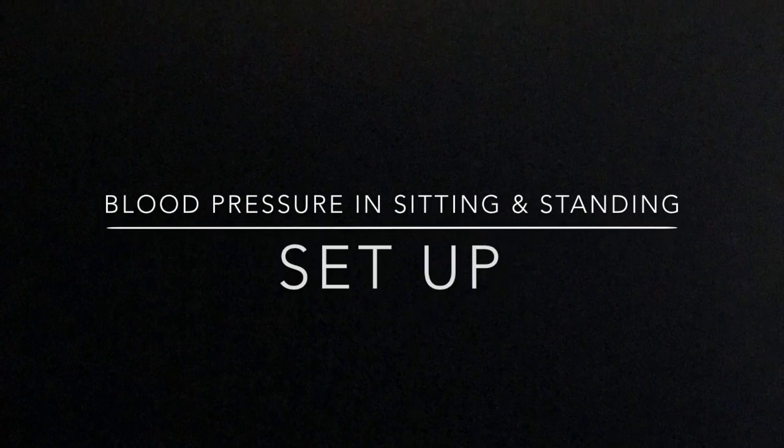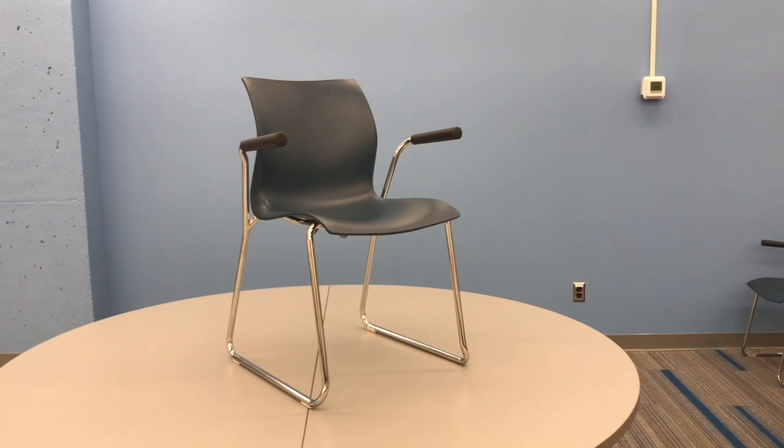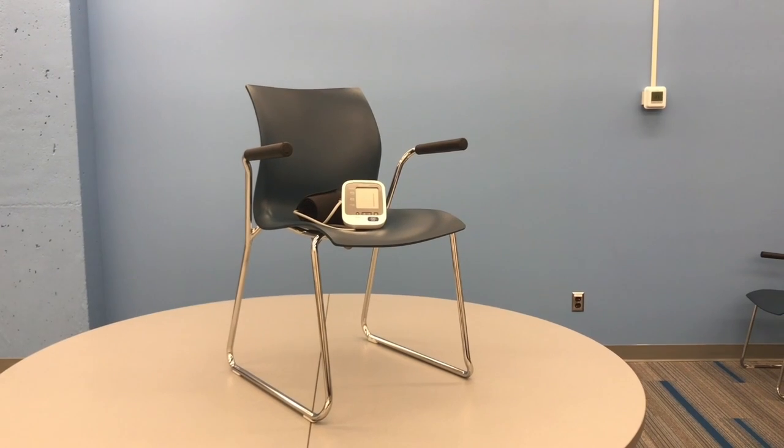Blood pressure when sitting and standing. For setup, you will need a chair, a table, a timer, and either a stethoscope or electronic blood pressure monitor.